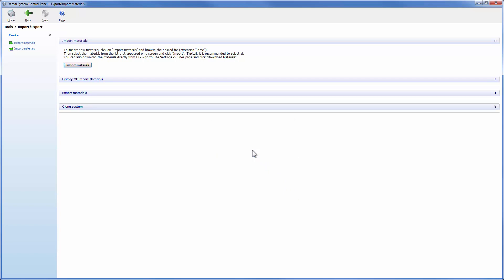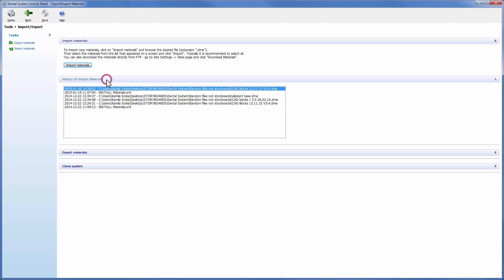The dental system software keeps track of all imported materials. You can find all imported DME files, their dates, names and locations under the History of Import Materials tab. Click on the tab to unfold the history.